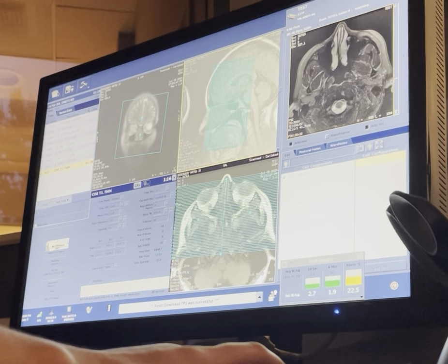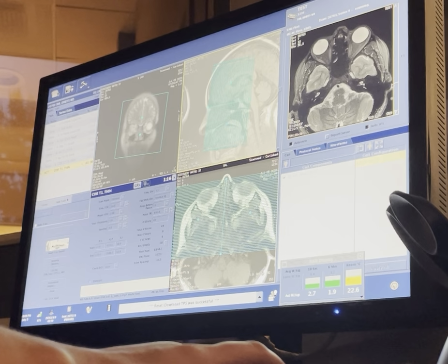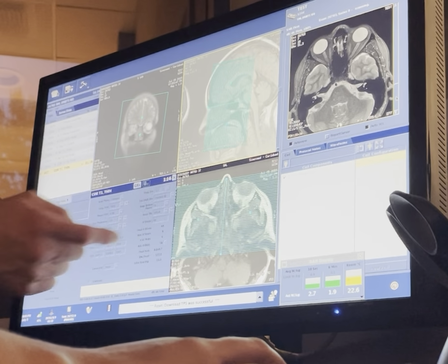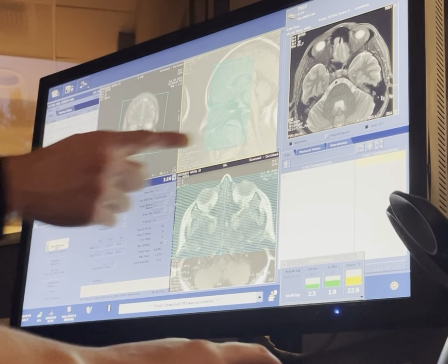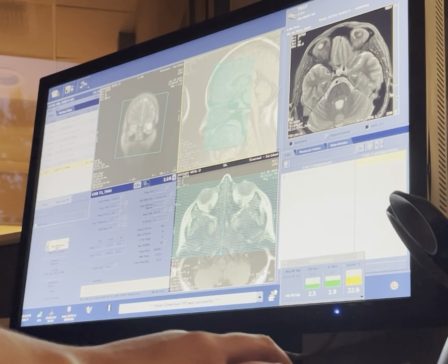So scroll through that one. Let's see if we can see the optic chiasm better. Slowly, instead of dragging it, just click anywhere in this column above or below. Yeah, you see that? So you can kind of follow the nerves now, right? In this scan, keep following them. There we go. You see they're about to cross over right there. Go one more. That's where it'd be.